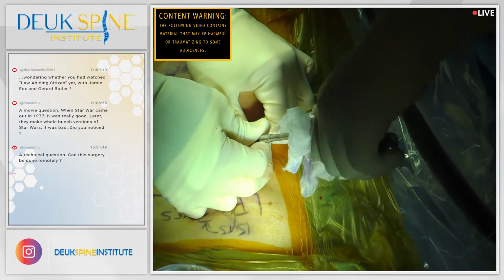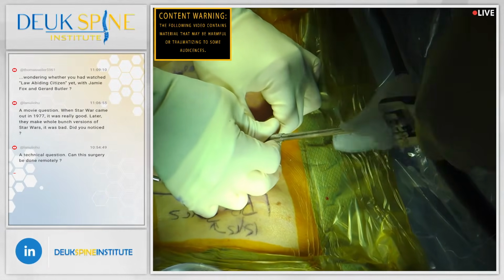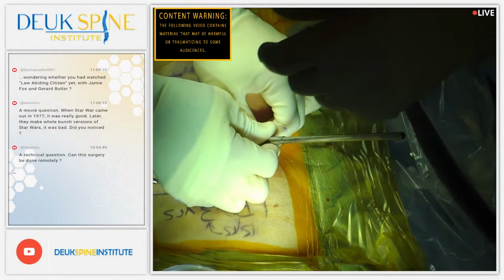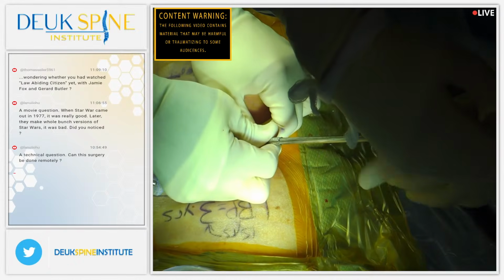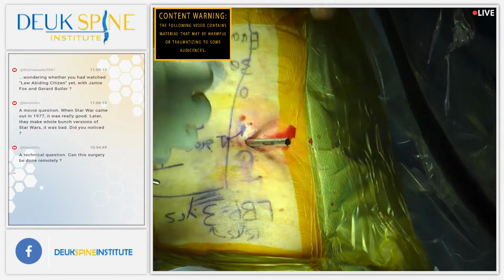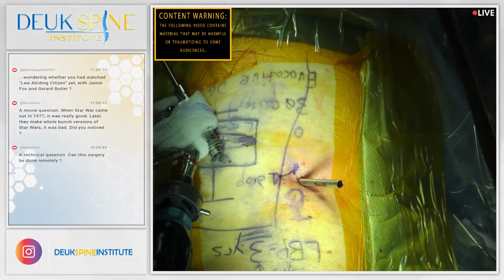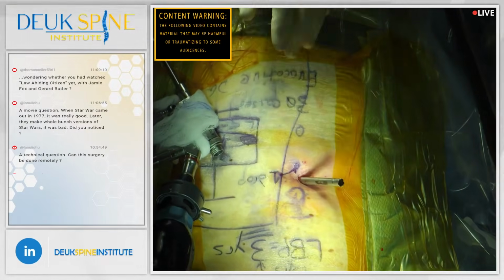I'm just dealing with my angina pectoris. Oh my God. What the hell? Look at this thing. The end must have been bent. Unreal. So this guy's crushed my dilator. Oh, it's bent. You can see the bend right there. The same when pulling it out, it looked bent. Unbelievable. Well, we got it out.